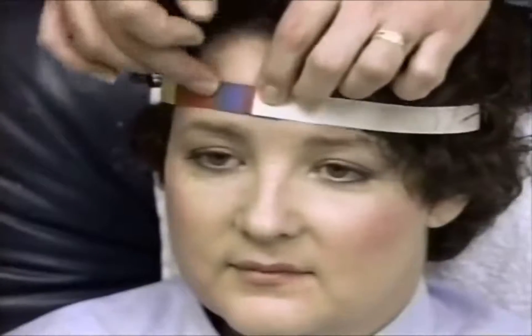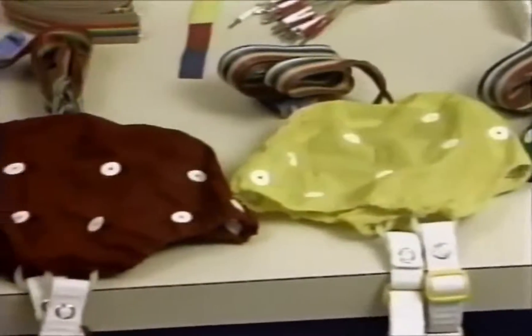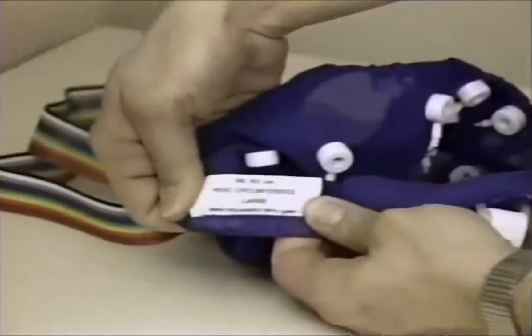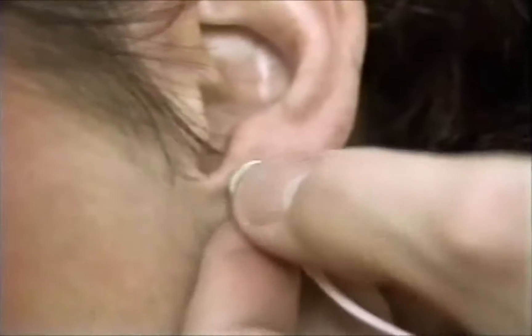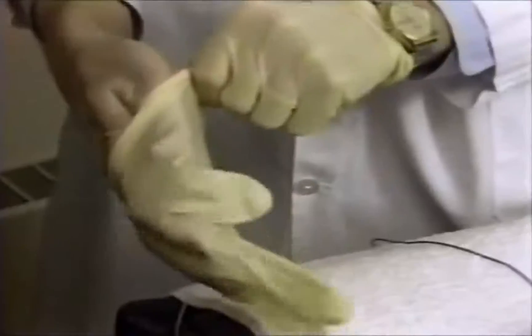The color-coded tape will indicate the color of the proper cap size. When using a metric tape, the size range is printed on the label of each cap. The ear electrode is clipped onto the earlobe, similar to a clip-on earring. For the patient's and technologist's safety, rubber gloves should be worn during the rest of the procedure.